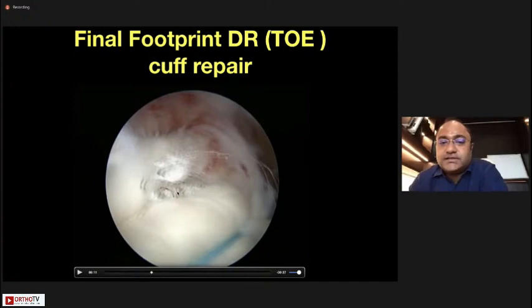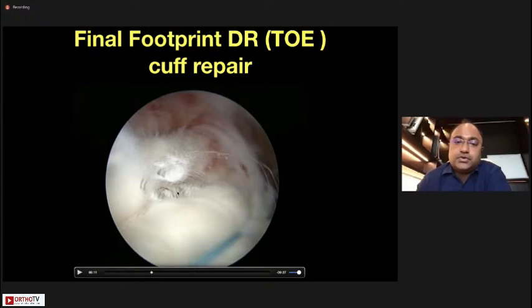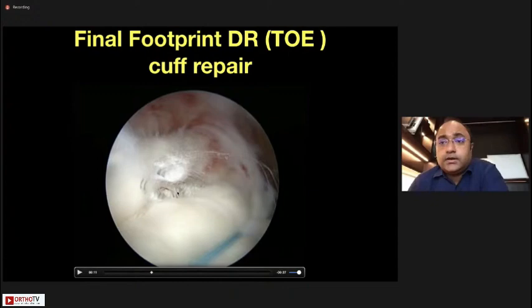You can use the Scorpion device or First Pass device as antegrade devices, or retrograde devices like the lasso from the back of the shoulder. Every tear pattern has its own approach — for a U-shaped tear you need side-to-side stitches.